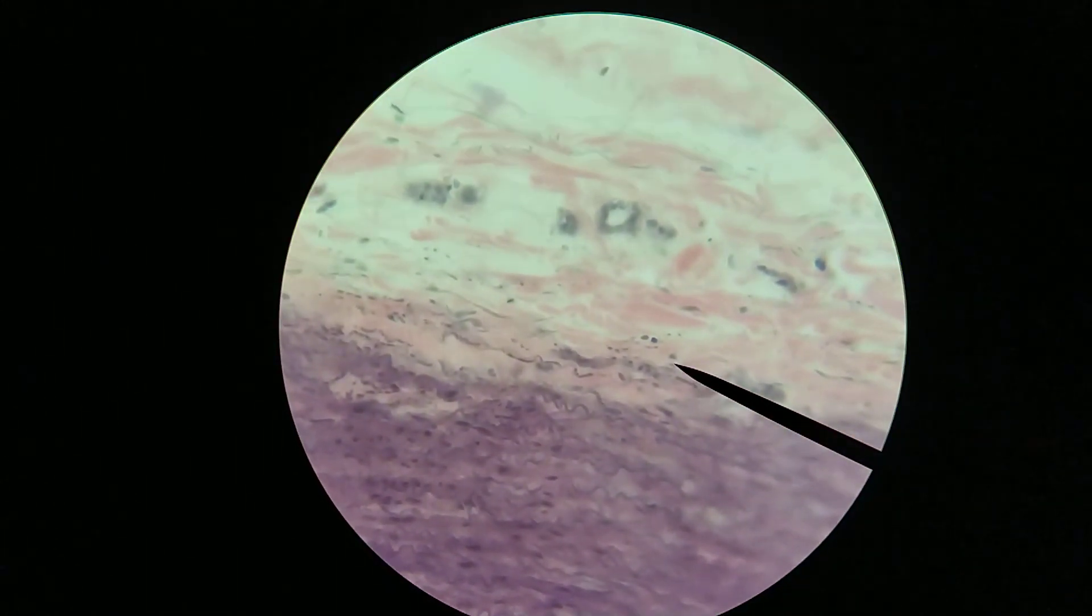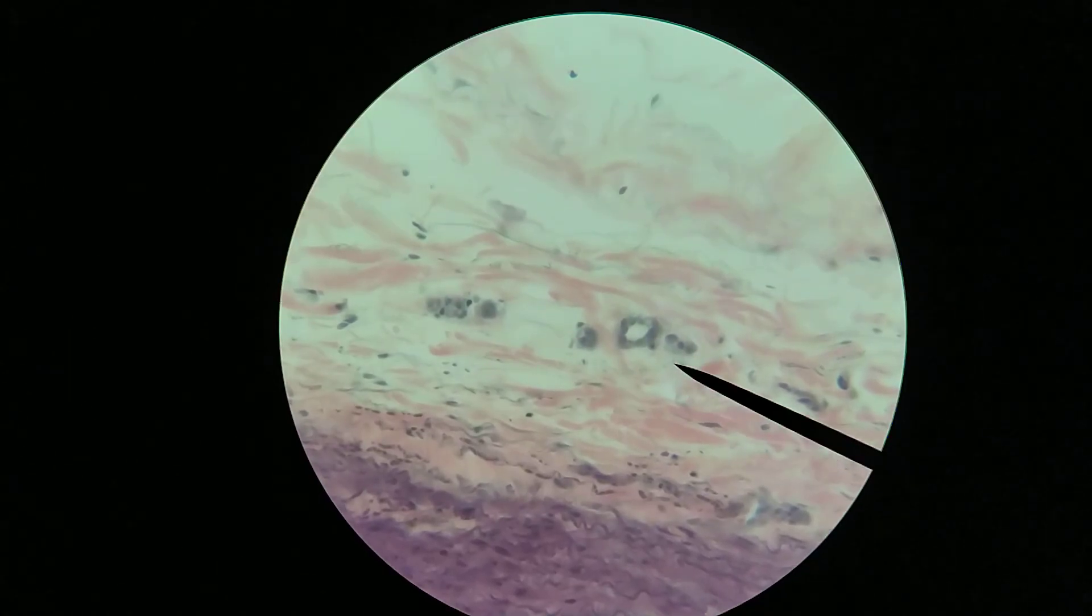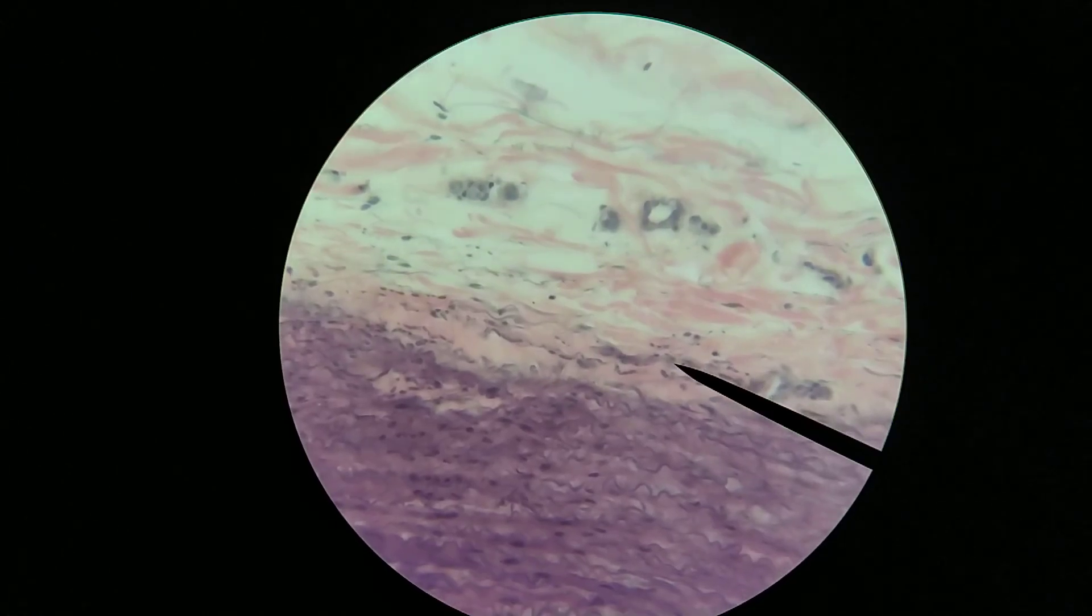But a lot of these cells, especially deeper in, will not be able to get that to diffuse all the way through. So you have to have support from the outside by smaller blood vessels supporting these tissues around the outside.